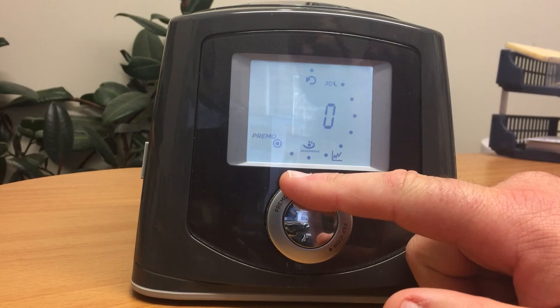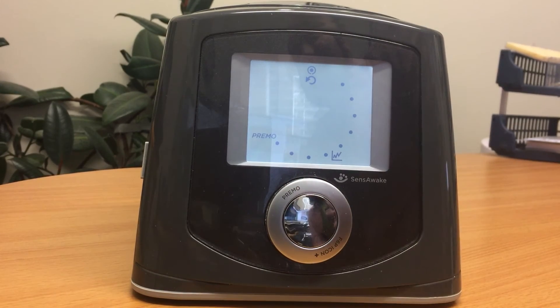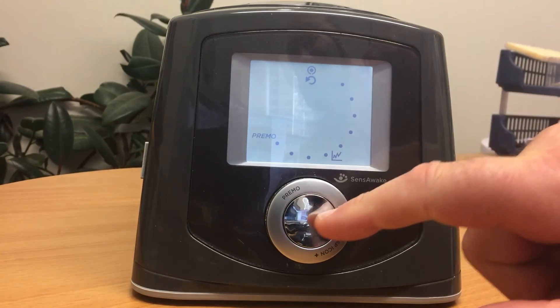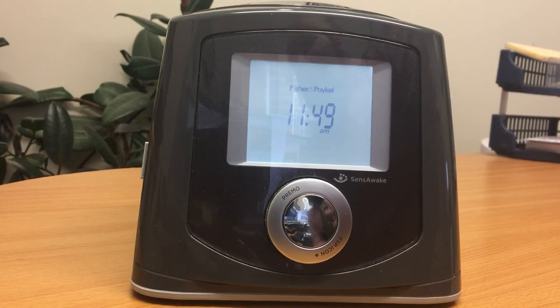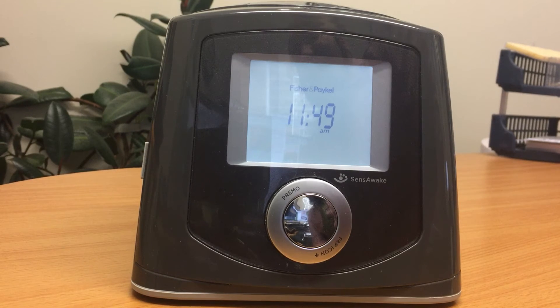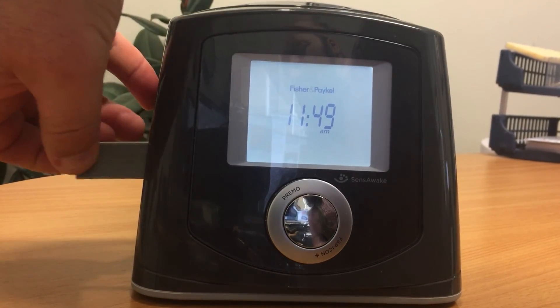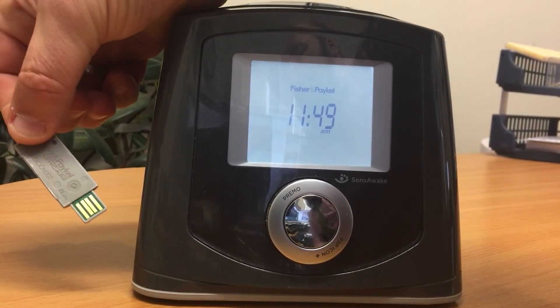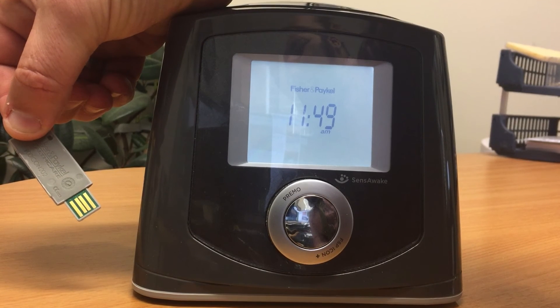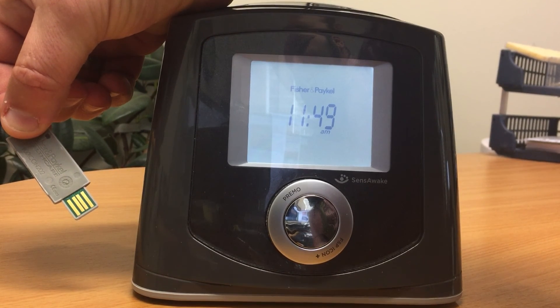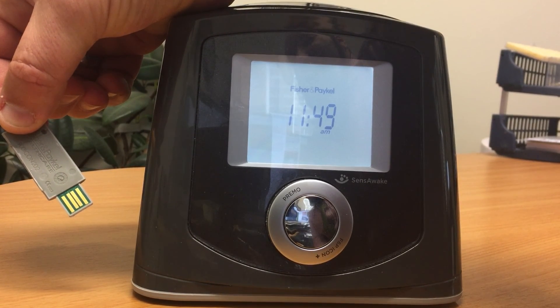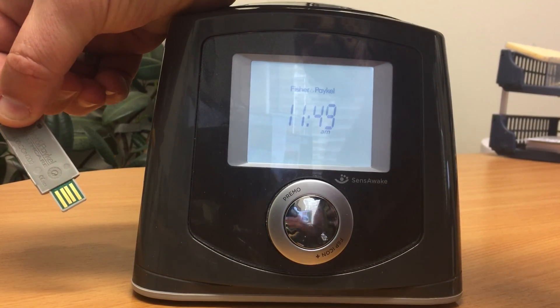To get back to the main menu, turn the dial to the very top of the screen to the little return arrow, then press the button to go back to the start screen. And that's how you do a manual read of the sleep data. You can also use the info USB stick to send the data directly to the clinic in more detail than you get off the screen.